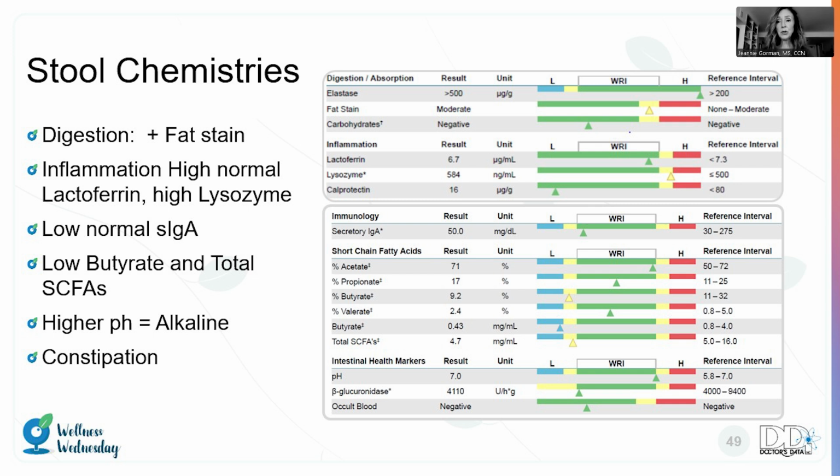The 3 most heavily researched supplements would be inulin, chicory root, or psyllium husk that feed the widest variety of species too, because different forms of fiber feed different species. So ideally, we'd want to get that butyrate back up. The low butyrate, low total short chains, and that high pH, short of having these dysbiotic members, this feels more like a constipated patient, this profile. Low butyrate, sort of increased inflammation because there's low butyrate, and a more alkaline bowel with a high pH.